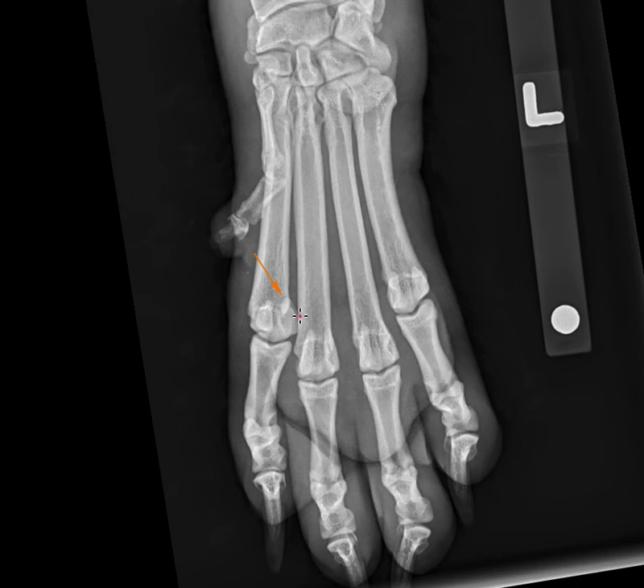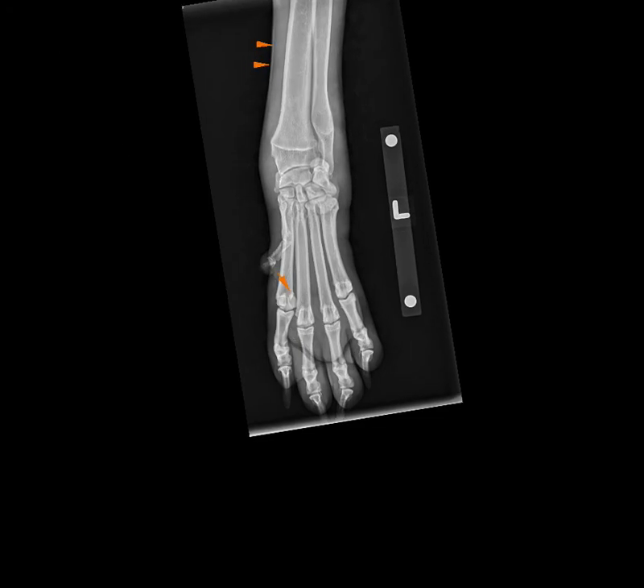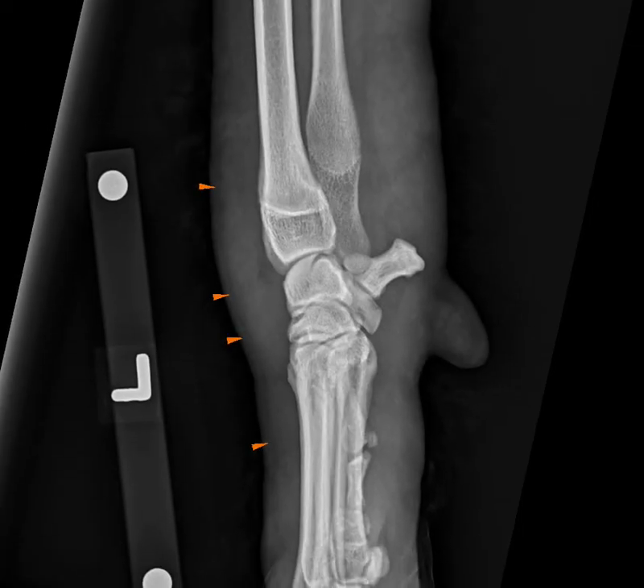A bipartite sesamoid certainly would not cause diffuse limb swelling as seen in this patient. Taking together our list of rule-outs: we've excluded fracture; we can exclude erosive joint disease like septic arthritis because we don't see subchondral bone lysis; and this appears to be very much extracapsular soft tissue swelling. Differentials to consider would be cellulitis of any cause — whether infectious, immune-mediated, or inflammatory. Be sure to review the full report associated with this case. Thanks for listening, and remember it's your case — please post your questions on social media.